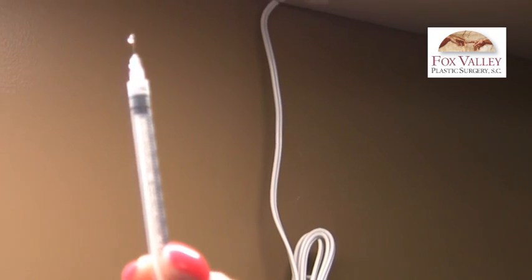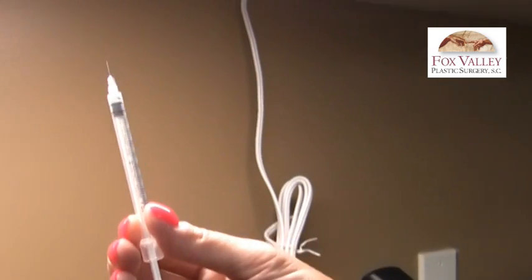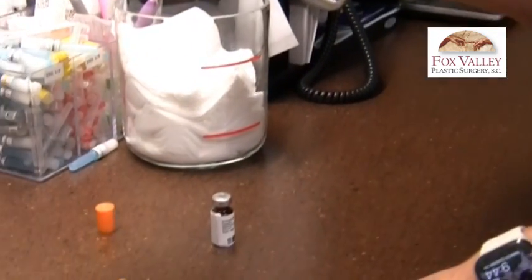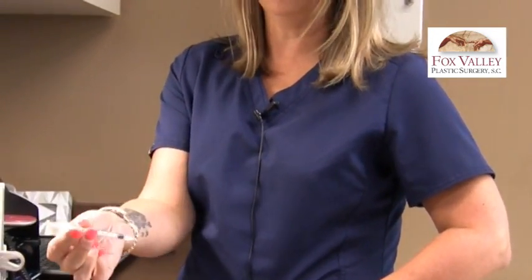That is the amount of medication you are injecting for the first time. While holding your syringe, alcohol off your belly about two to three inches away from your belly button on either side. You can also inject in the thighs if you're more comfortable doing that, but most patients inject in the belly. Wipe off that area with an alcohol swab.